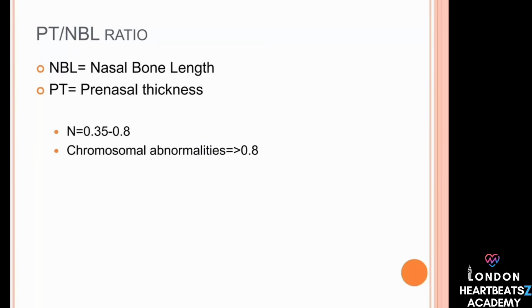Correct. While the raw formula notation for the studied relationship is quite technical, the takeaway for the sonographer is that there's a specific relationship between these two measurements, and if that ratio exceeds a certain threshold, it significantly increases the suspicion for underlying genetic conditions. So it's a calculated risk indicator based on those specific measurements. And the most discussed finding related to the nasal bone, the big one.